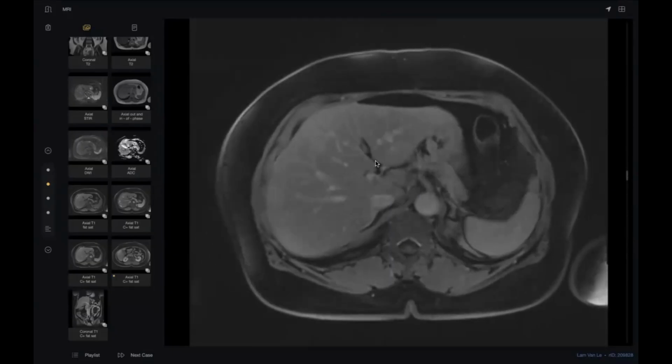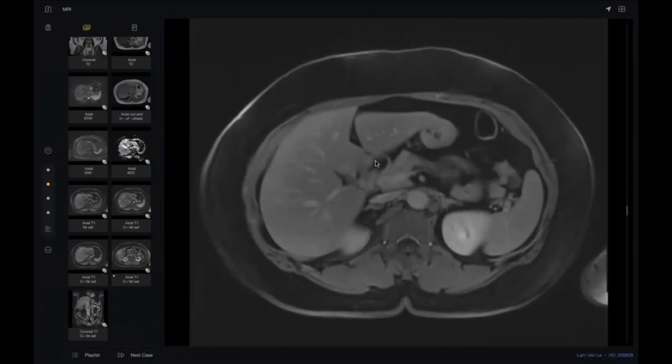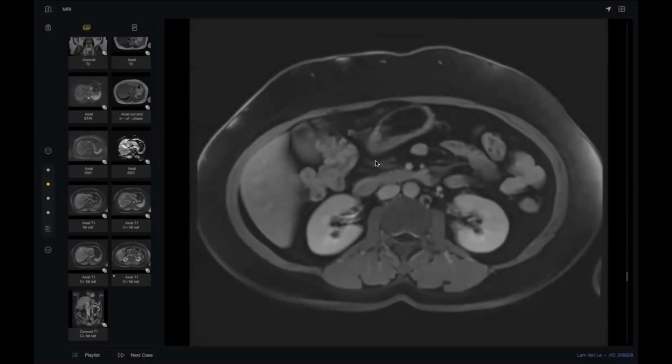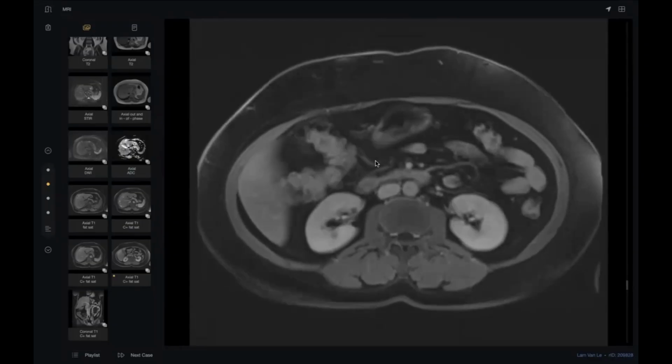And when you give hepatocellular specific contrast, it takes enhancement. Okay? Why? Because it contains hepatocytes. Okay, doctor? Okay, sir. But adenoma and metastasis didn't take contrast in the delayed hepatocytic phase.